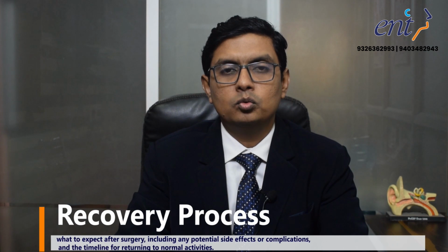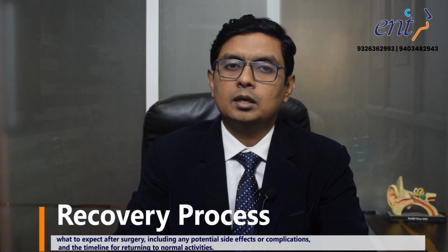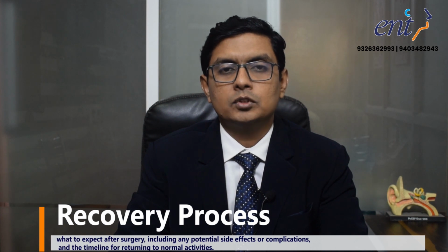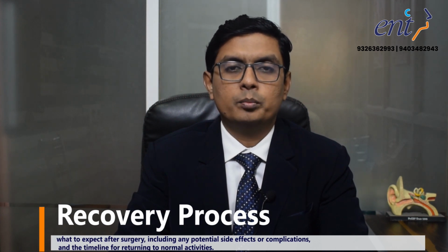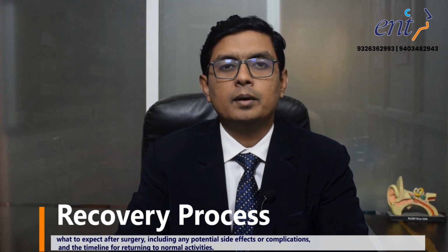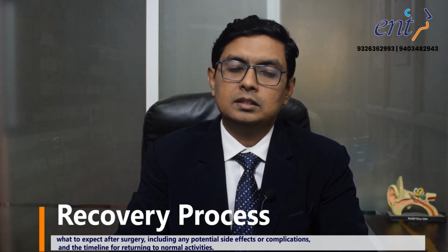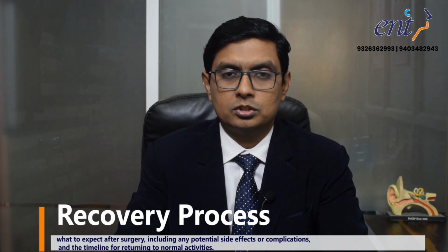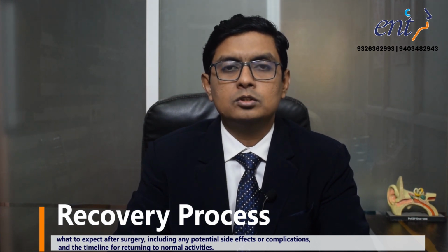After the surgery, after say 2 weeks, there is a complete recovery. We call the patients in the first week to do an anterior rhinoscopy examination, sometimes an endoscopic examination, and try to clean out the crust and secretions. In the second visit, after the second week, we do similar nasal endoscopic procedures. So after 2 weeks, most patients do not require to visit the doctor again.